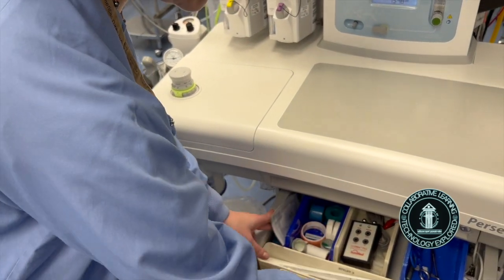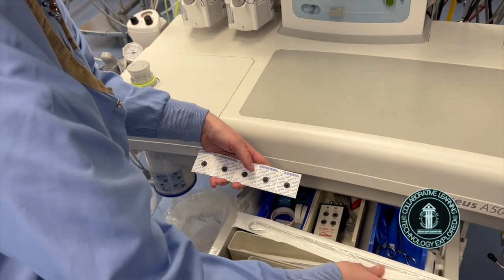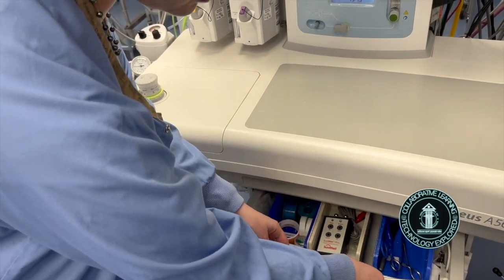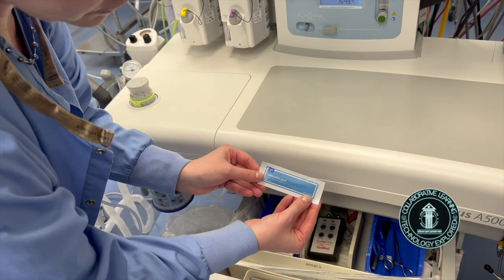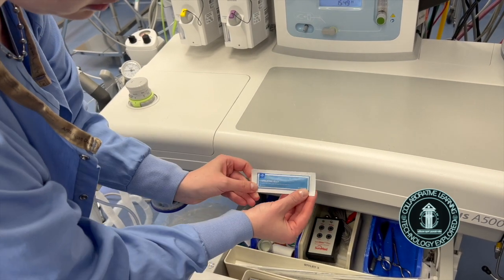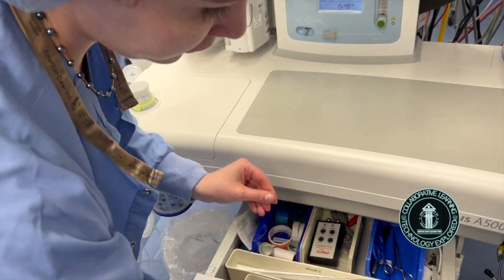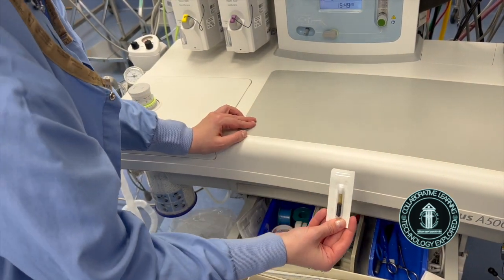Those are two different kinds. And we have EKG monitors, and we have stylets for ET tubes. Also, a few things that are here. We usually have the surgical lube. It's just a lubricant, and we have benzoin here to secure tubes or IVs or A lines.